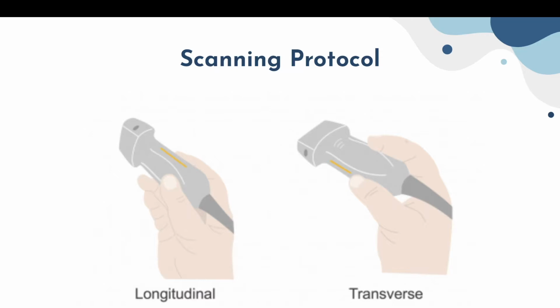So this is just showing a linear probe, and each ultrasound probe has a marking on it, which you can see. The marking for sagittal has to be cephalad. The probe has to angle straight. For transverse imaging, it has to point to the right. And this is the patient's right, not your right. So when you're scanning facing the patient, the probe should face the patient's right.